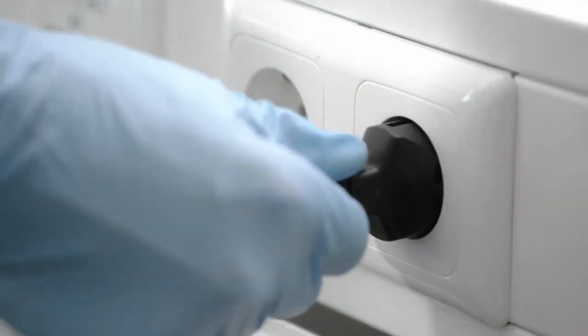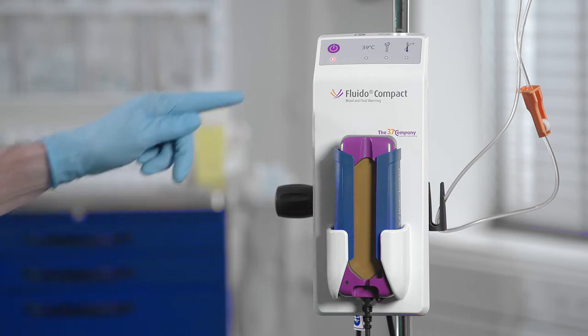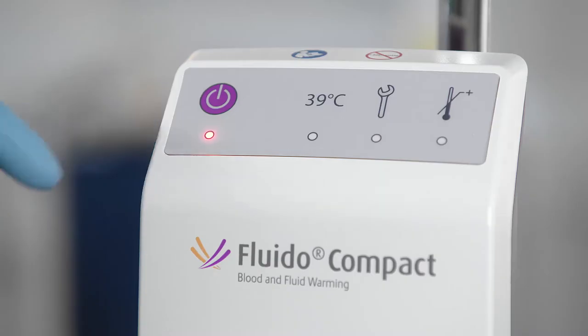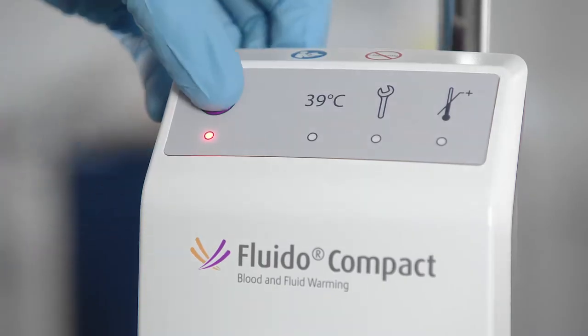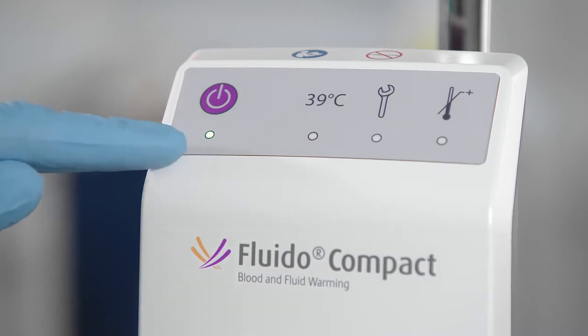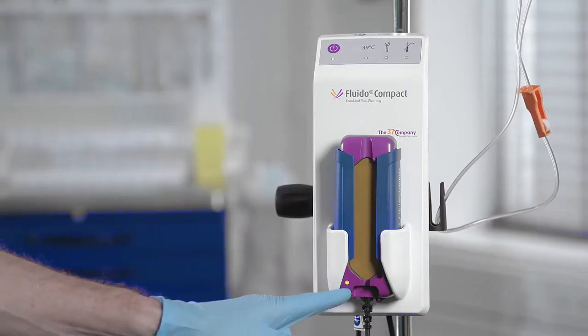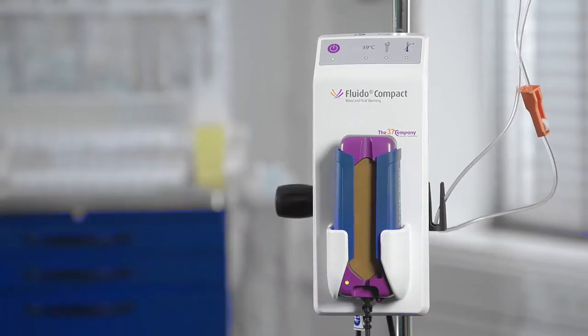Connect the power supply cord to an earthed wall socket. The standby and on indicator LED on the control module is now orange. Push the standby and on button. You will hear a single beep. The indicator LEDs on the control module flash one time, and the standby and on indicator LED stays green. The status indicator LED on the warming module is now orange.